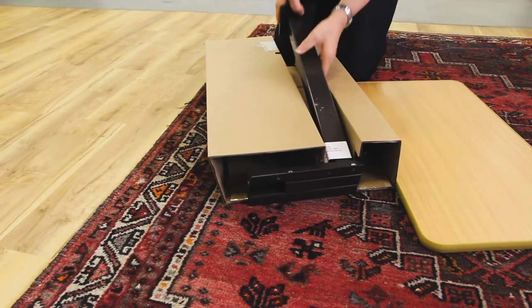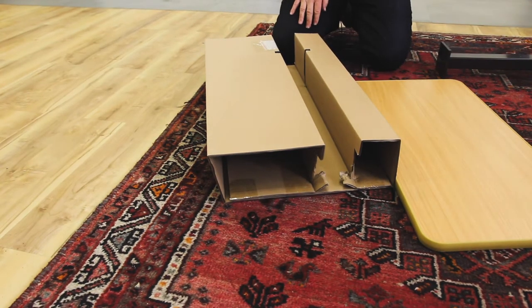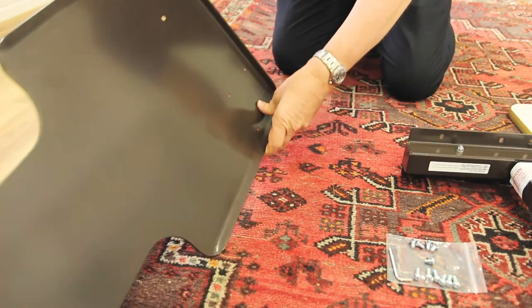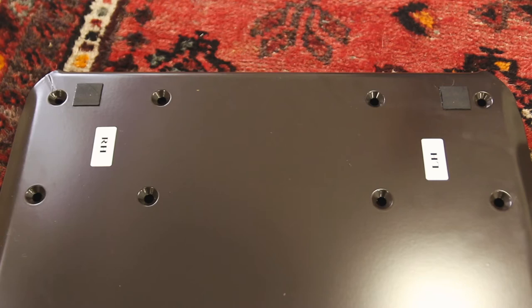Before setting up the table you need to decide which side of your chair you want the tabletop to overhang. Underneath the base plate, two markers let you know where to attach the column depending on whether you want the table on the left or right hand side.